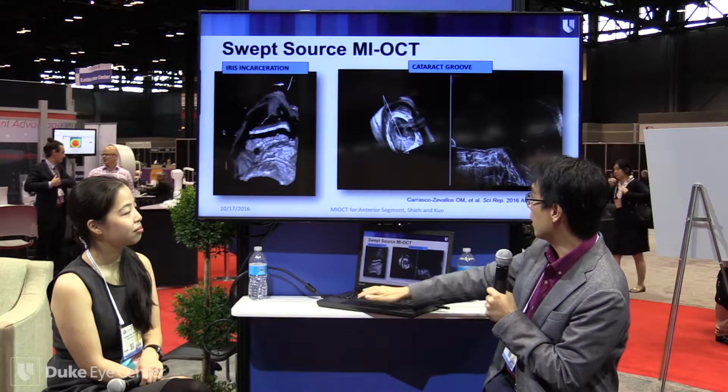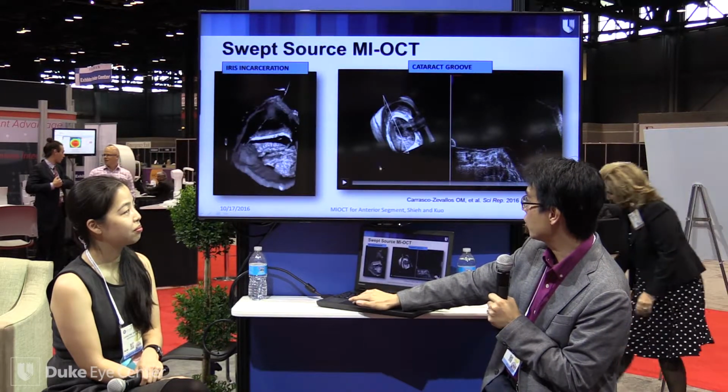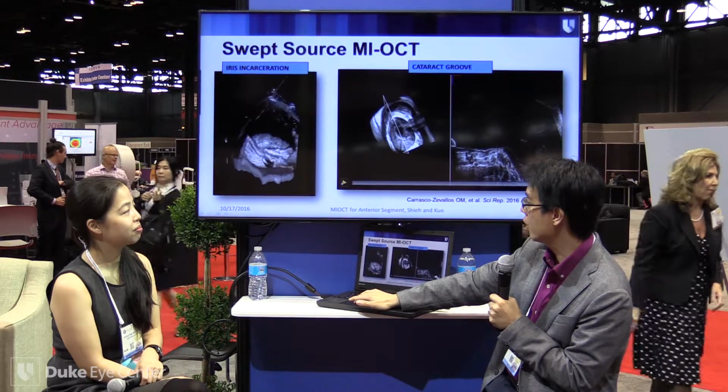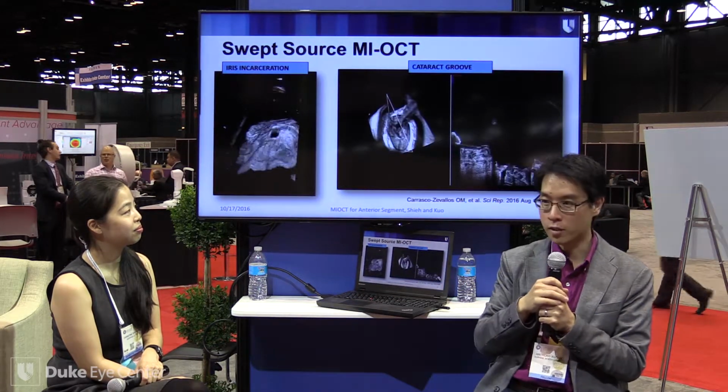This is phacoemulsification, which is cataract surgery. You don't really need fancy visualization because people are really good at cataract surgery now. But this is just kind of cool to see what this looks like on a 3D scan.